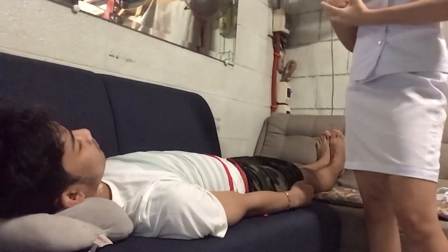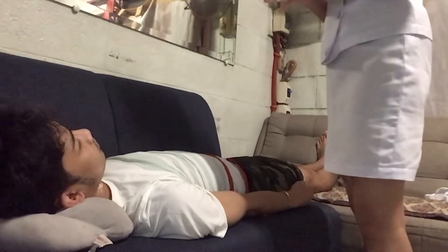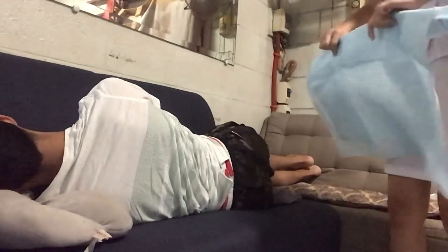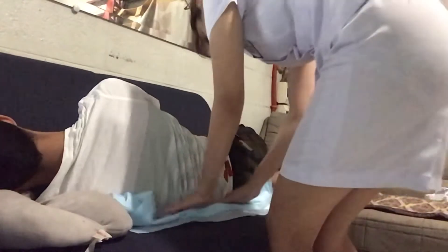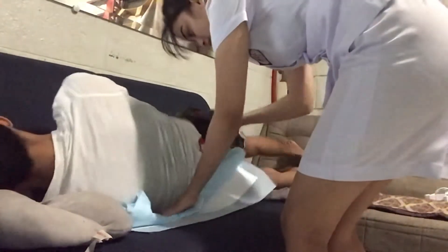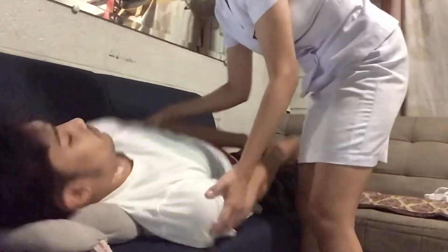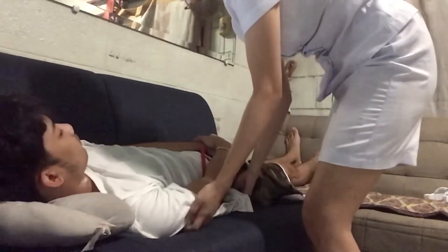Place the waterproof pad under the buttocks by asking the client to turn to the side. Ma'am, please turn to your side. Slide the waterproof pad in place.